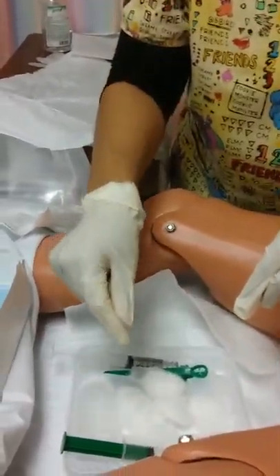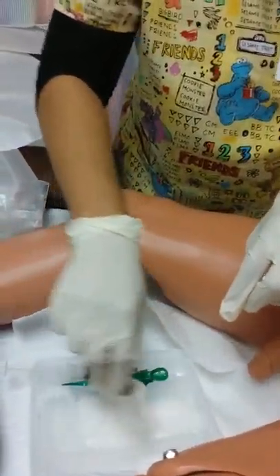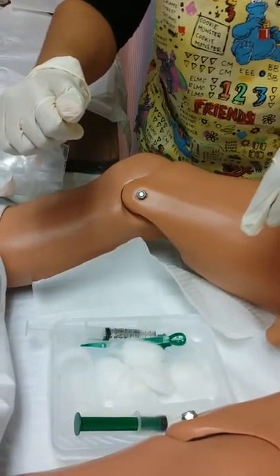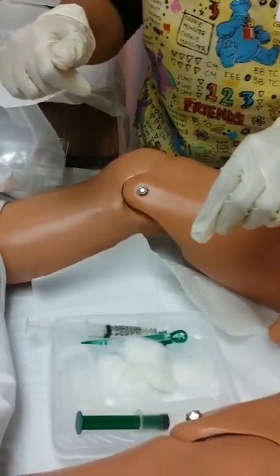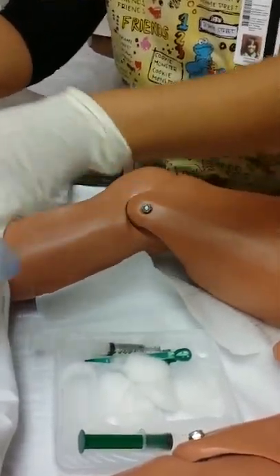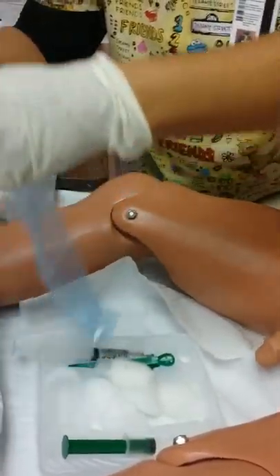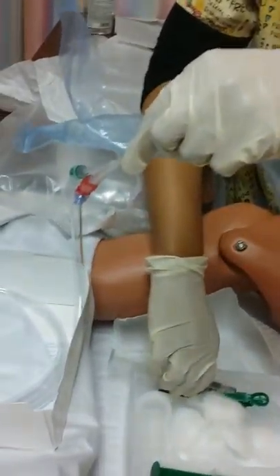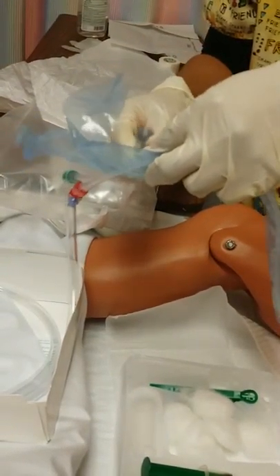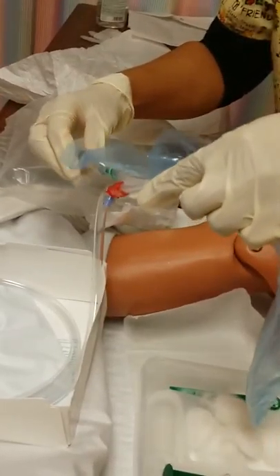Okay, and put my lube down, and then I'll put the syringe on here, just so some of this will already be done. Now, some people like to test the balloon first to make sure it works, but we're going to say it's working today. Okay.